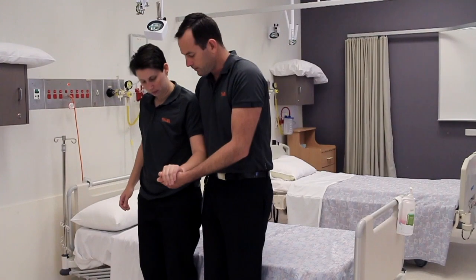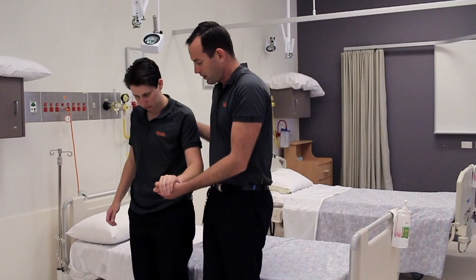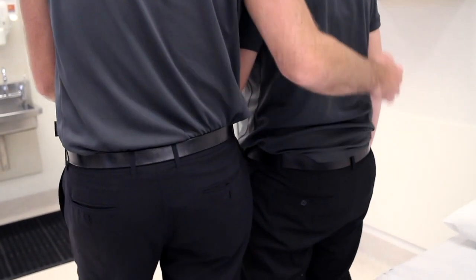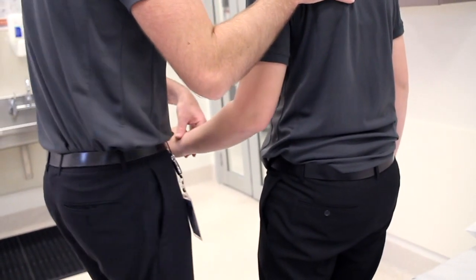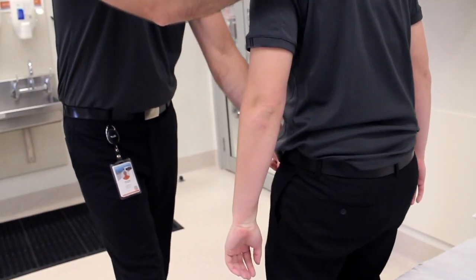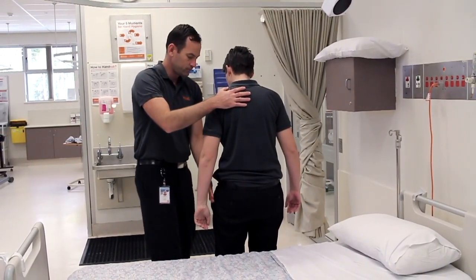If they need physical assist for support, we would look at more of a mobility aid. During the transfer, we reverse up to the destination — in this case the bed — and the environment has already been checked. We guide the consumer's hand back to the bed and may facilitate some light pressure at the front of the hip and the back of the shoulder to facilitate a sitting posture.